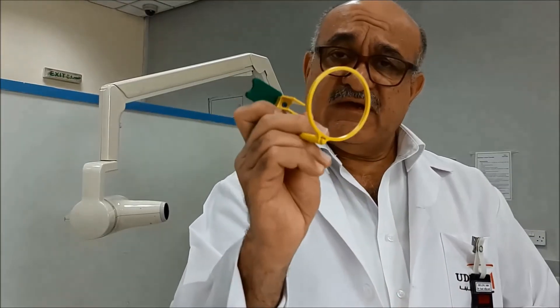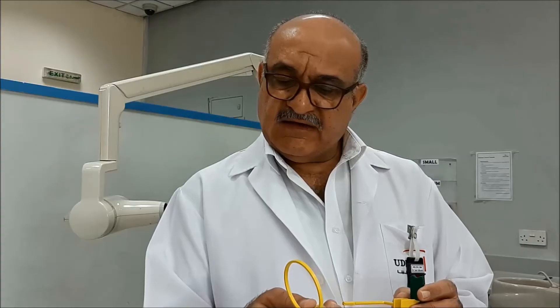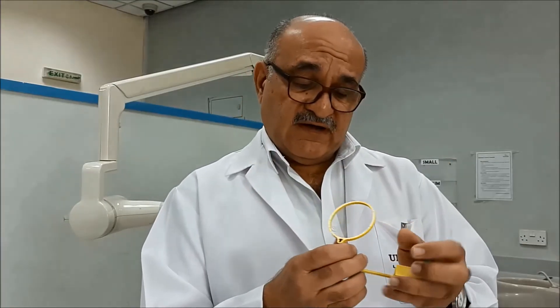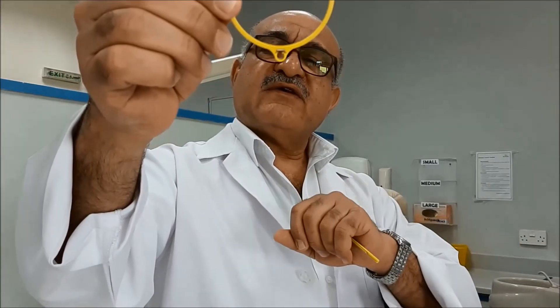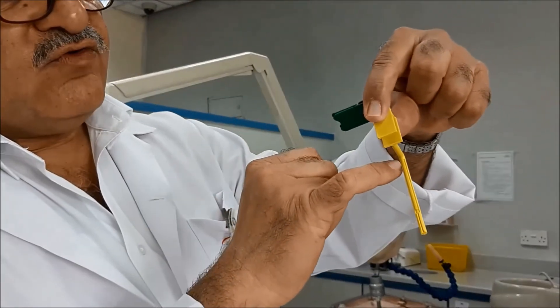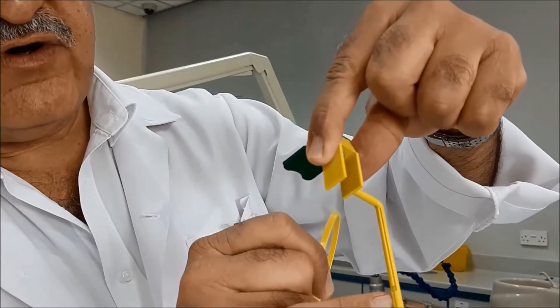We will start with the green one, which is used for the upper and lower anterior teeth. All types share the same components: the ring aligner, the connecting rod, and the bite block. In this specific type of sensor holder, there is a notch inside the ring circle, and on the connecting rod there are two grooves — one on each side — that join in a common groove.